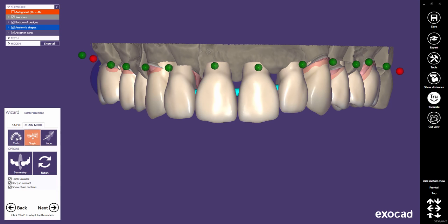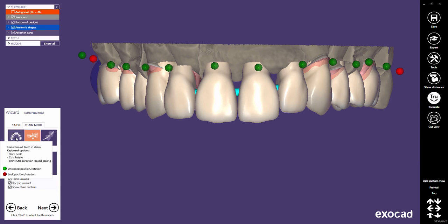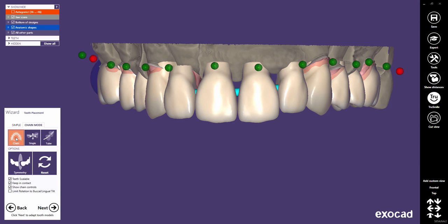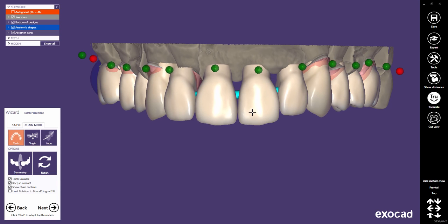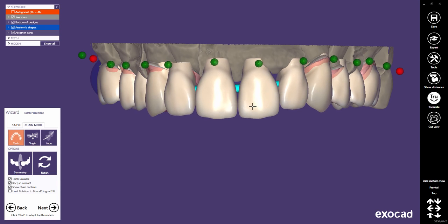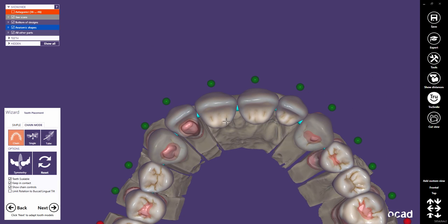Let's look again at chain mode to compare both modes. Moving a single tooth in chain mode will move a series of teeth. The greater the distance, the less the movement's influence.